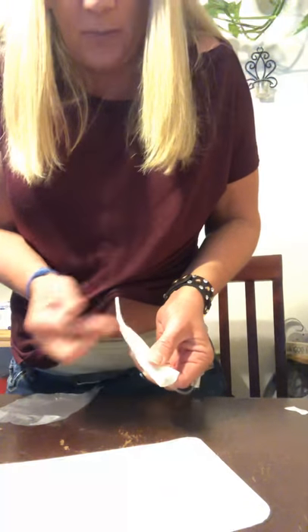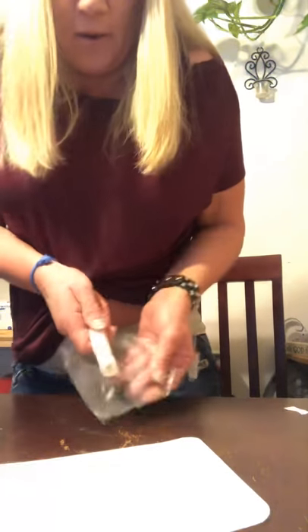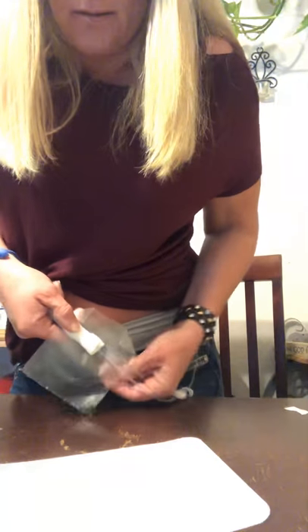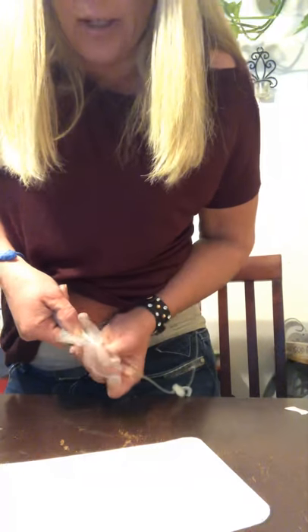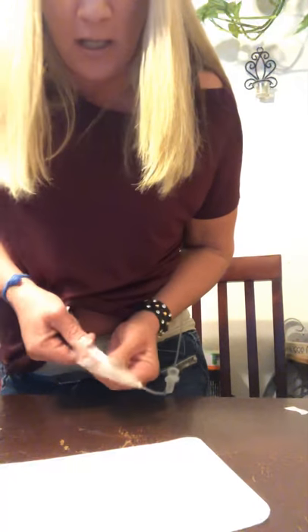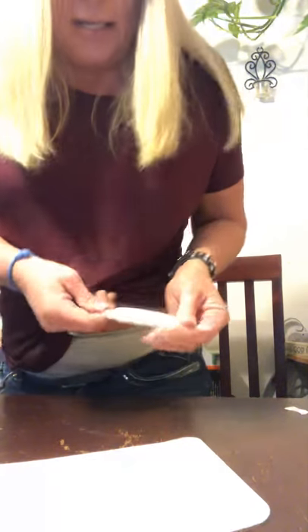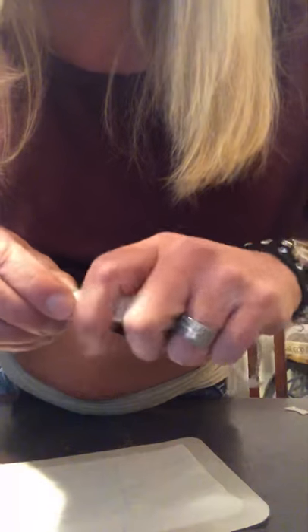Then take the other piece and put it down there, pinch it up till it sticks, fold all the way over, and do the same thing — pinch off a little corner and fold it. Make sure it's nice and snug. That way it's all nice and snug and just rolled up.